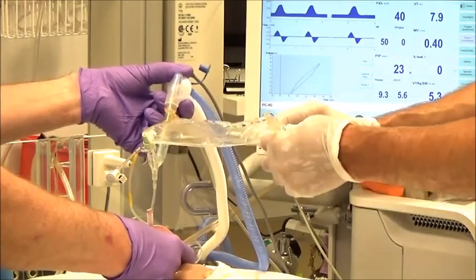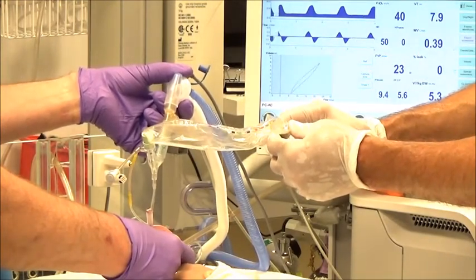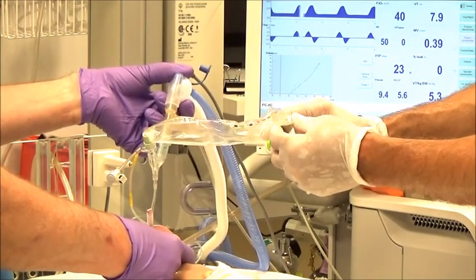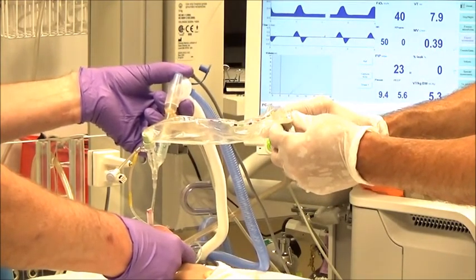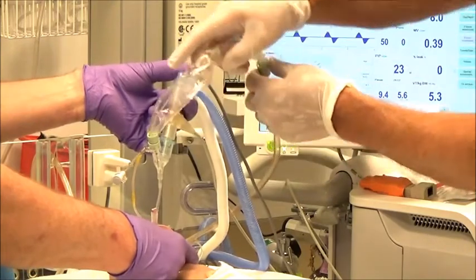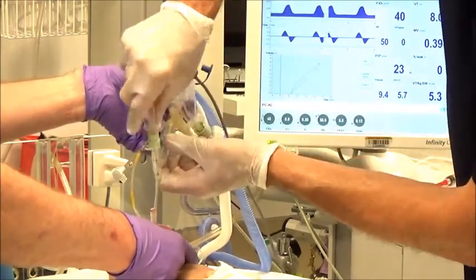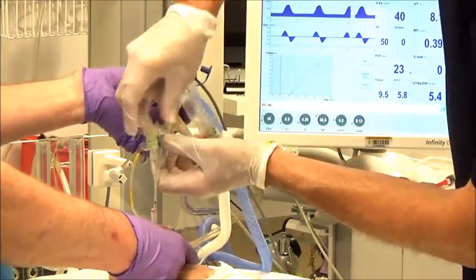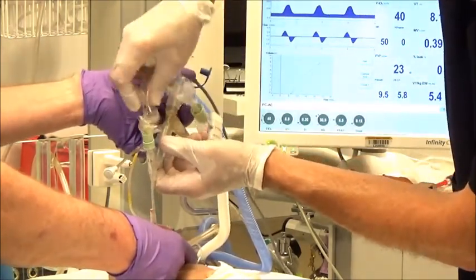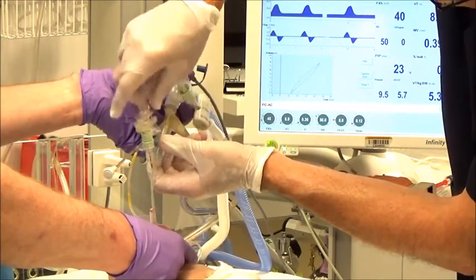As with any medical procedure, perform hand hygiene and don PPE as per IP and C guidelines. Suction the baby prior to BLESS delivery to remove any excess secretions that may interfere with the effectiveness of the medication.